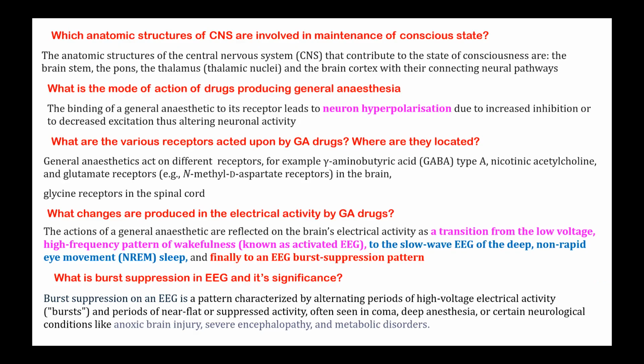Okay? And the percentage or the ratio of this burst to the suppression is used to assess the depth of anesthesia. So if the frequency of stimulation comes down, that means you are taking the patient deeper and deeper, because there are more flat lines rather than the elevated activity. So that is how burst suppression has become a very important component, especially of the entropy type of management.